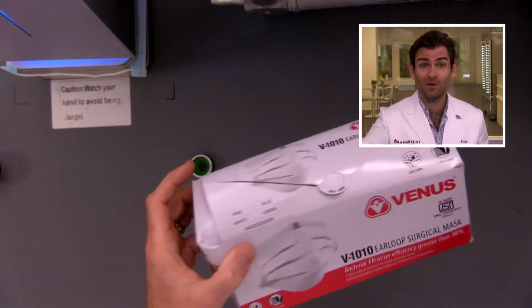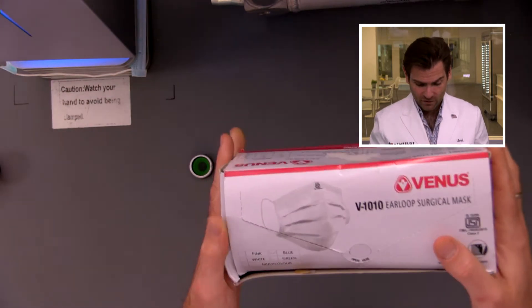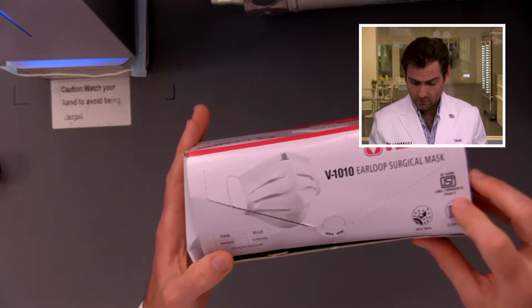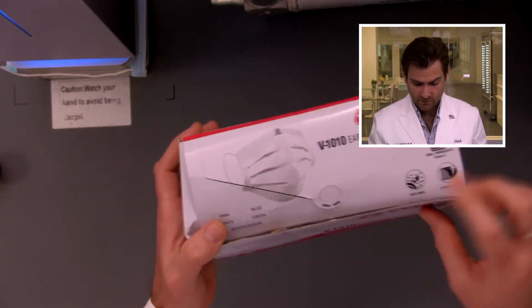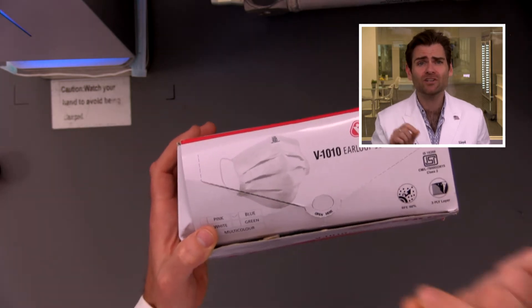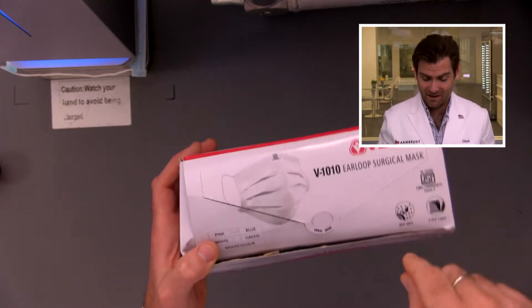You need both fit and filtration when considering the right type of mask to wear. The Venus mask seems to be a pretty legit brand — they're doing powered respirators and everything. This is the V1010 ear loop surgical mask, class two. They're saying a BFE of 98%, but bacterial filtration is not really important when it comes to COVID — you need to look for PFE. I think this is misleading.